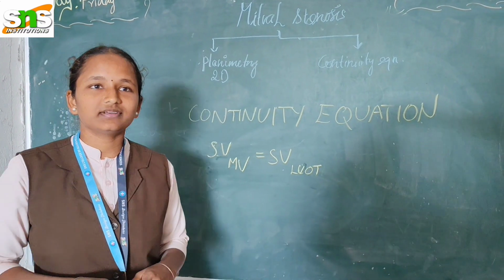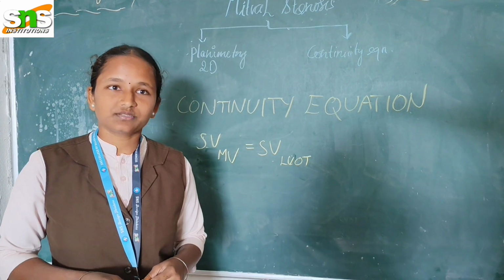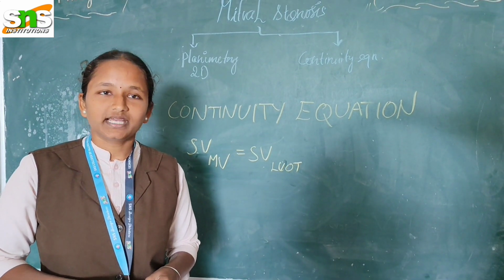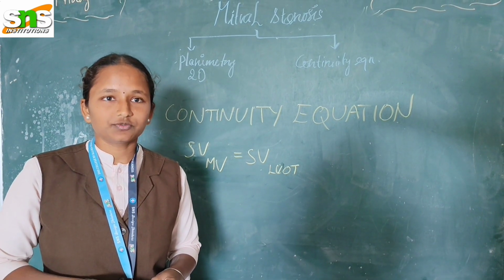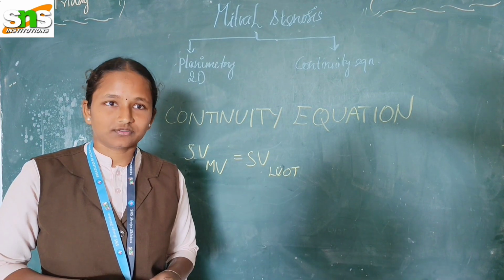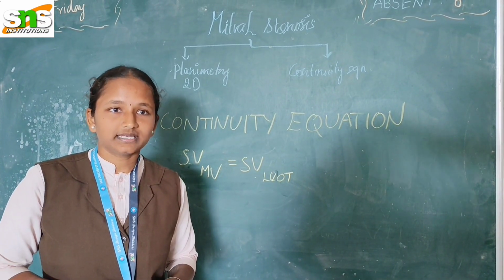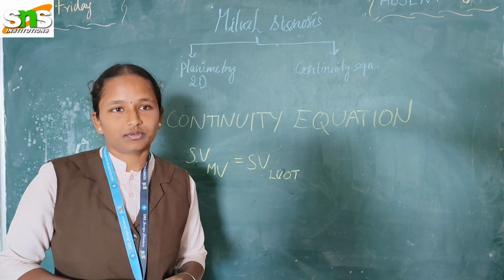Using this principle, the mitral valve area is calculated by dividing the flow through the LVOT by the diastolic transmitral flow velocity time integral. Since flow is the product of cross-sectional area and velocity time integral, mitral valve area can be derived indirectly. This method is particularly useful when planimetry is not feasible, such as in cases of poor acoustic windows or heavy calcification, and when pressure half time becomes unreliable, for example in atrial fibrillation, associated aortic regurgitation or altered left ventricular compliance.